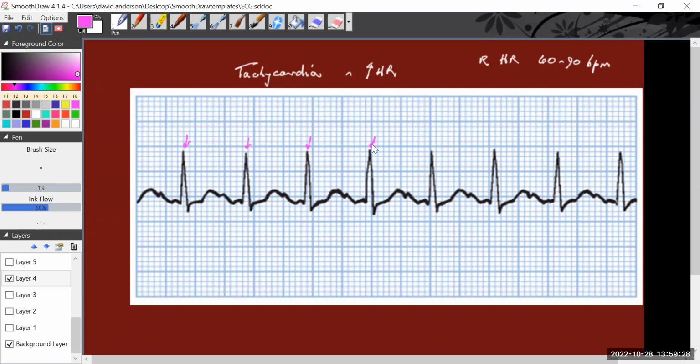And then we change the terminology because our ECG is still showing that there's atrial contraction prior to ventricular contraction. So there's our P wave. It's kind of blended with the end of the T wave. That's T, that's P, and this is our QRS. So the sequence is still there. The frequency has been increased, and this is just an example of tachycardia.